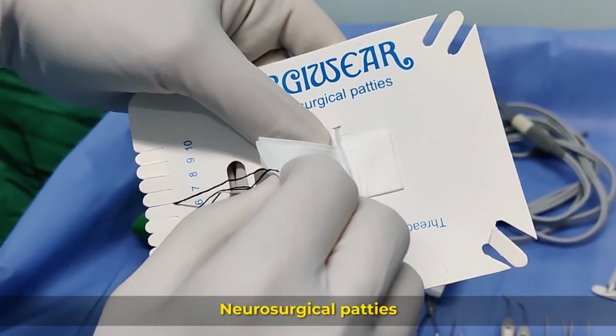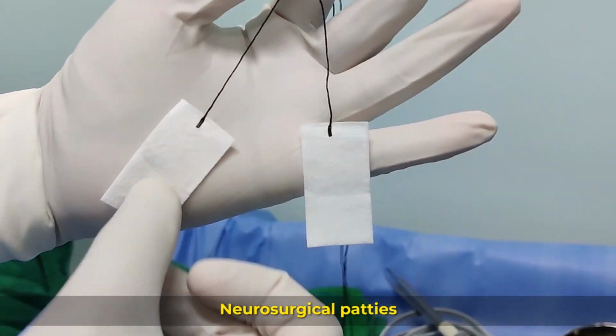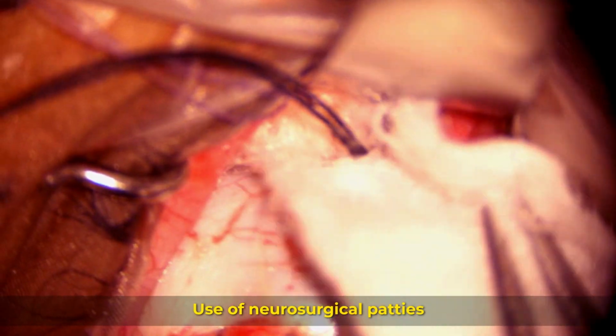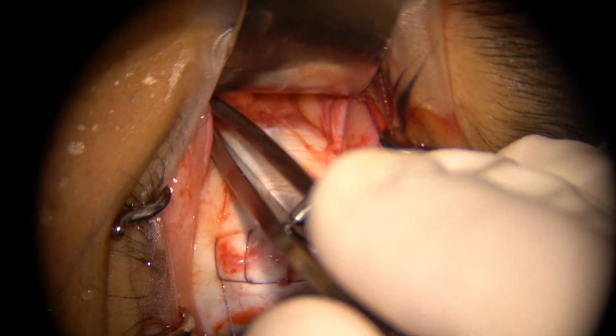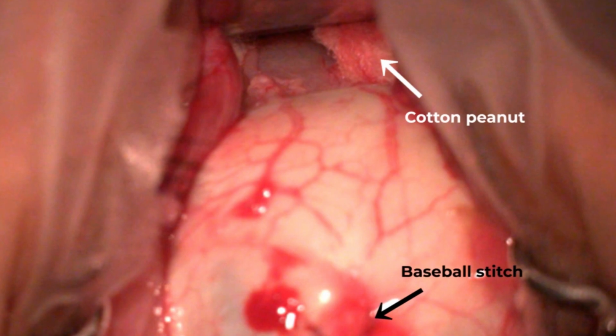Use neurosurgical patties. These are used as retractors to push the fat on either sides. And in addition, you can also use the cotton peanuts to give you the same. Here you can see the neurosurgical patty have nicely pushed the fat away, exposed the optic nerve head, and you can easily go ahead and do the decompression.